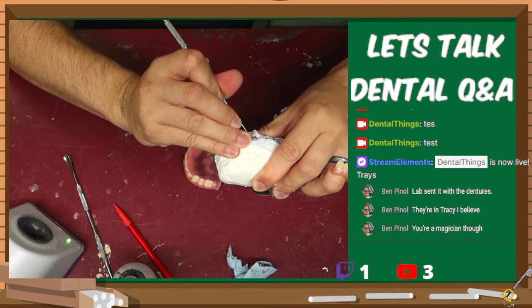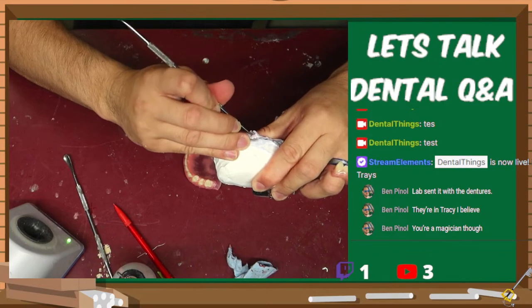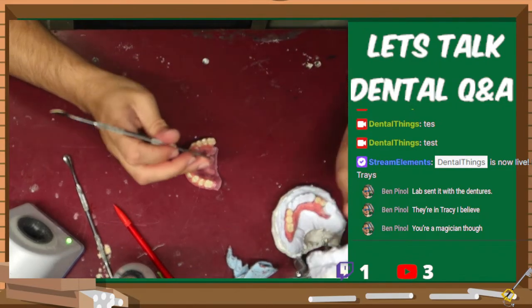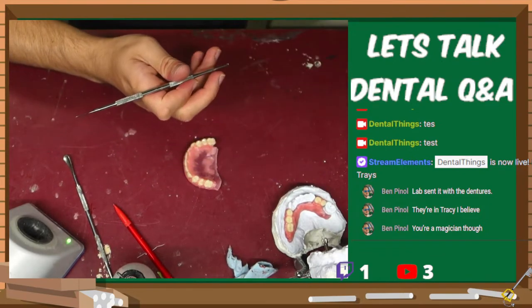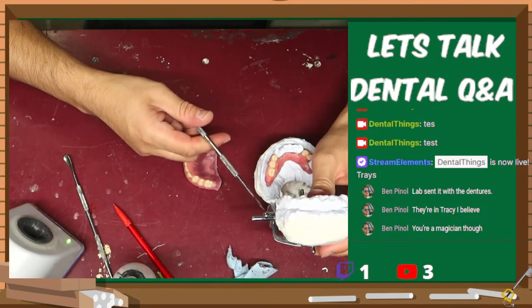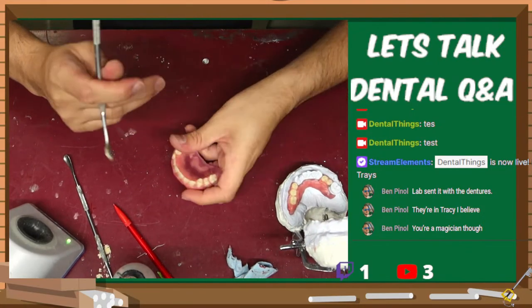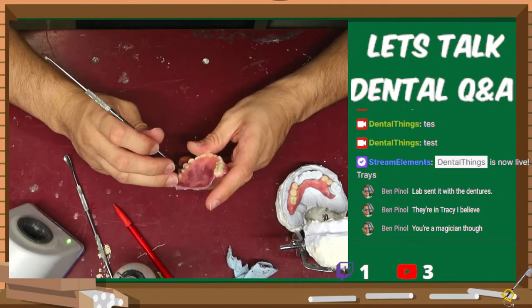By the time it gets to the wax try-in or whatever, if Doc has an issue with it, then we will tackle it when that issue comes about. Until I get something that's just unusable, I'm just gonna keep trekking on the best that I can.